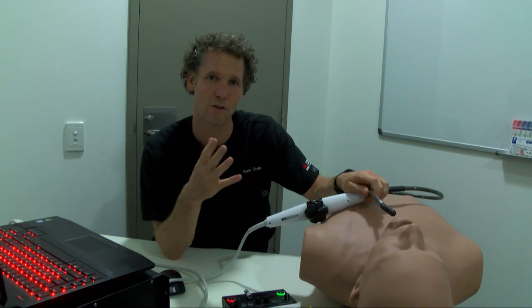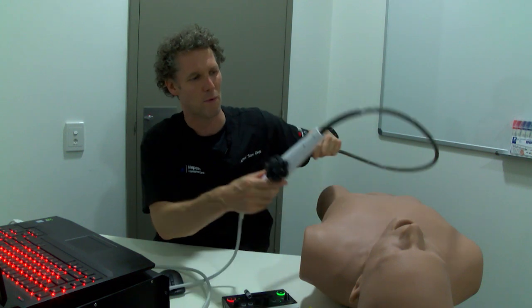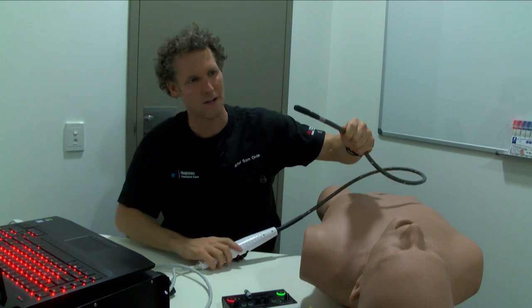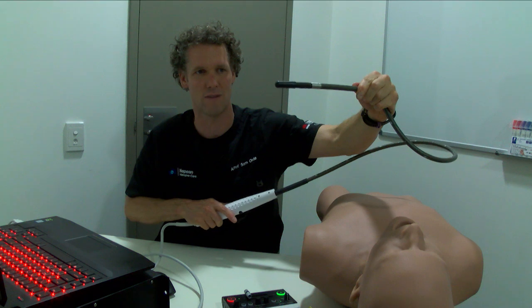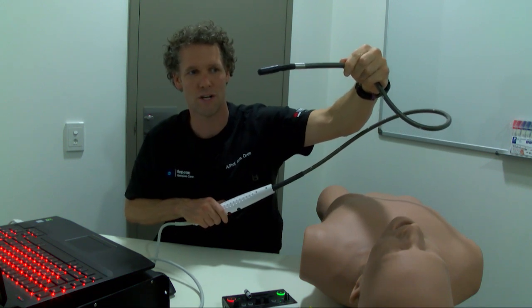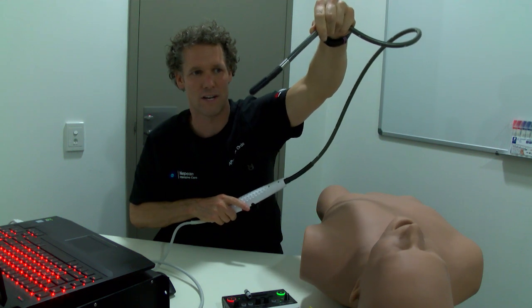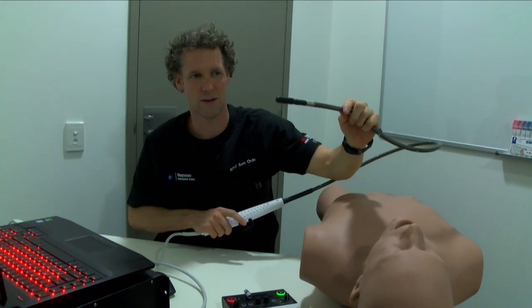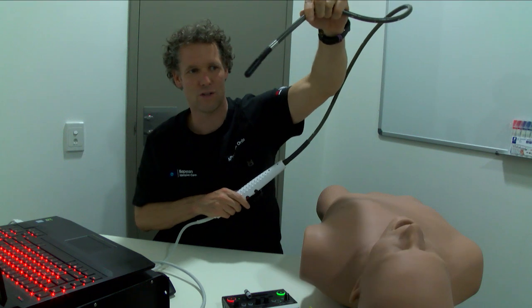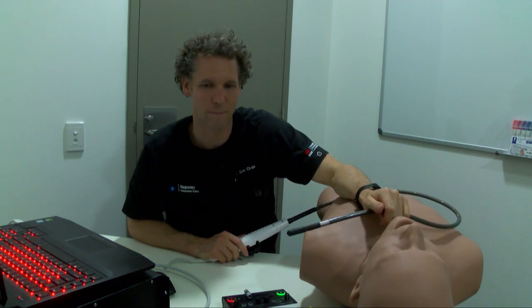Let's talk about how to stick the probe in in a safe manner. If you've got a patient who's intubated, obviously you can't ask them to swallow. First, find out which way the ultrasound wave is coming out. As I put the probe in, I do a little bit of retroflexion to go along the hard palate. I use a bit of anteflexion to help lead it around the back of the tongue, then go back to retroflexion to lead it down the esophagus - retroflexion over the hard palate, anteflexion around the tongue, retroflexion to avoid the trachea.